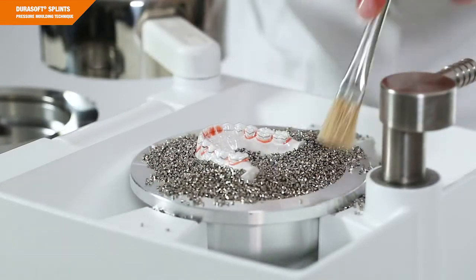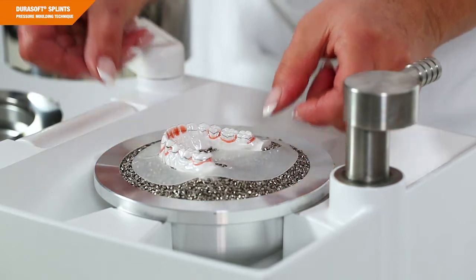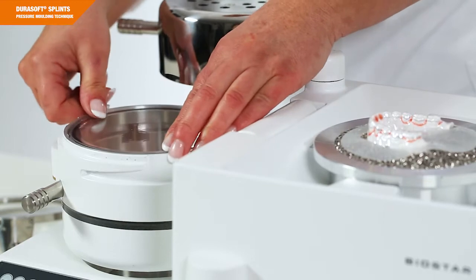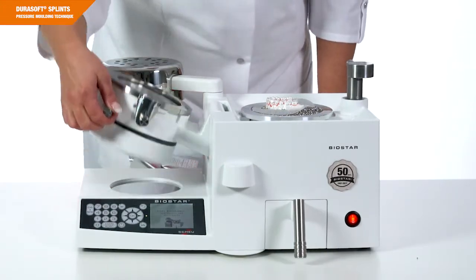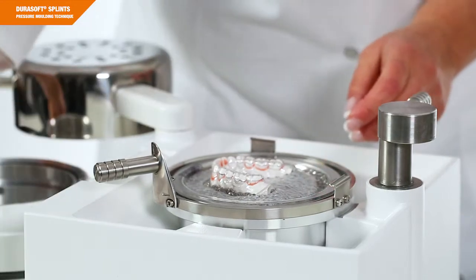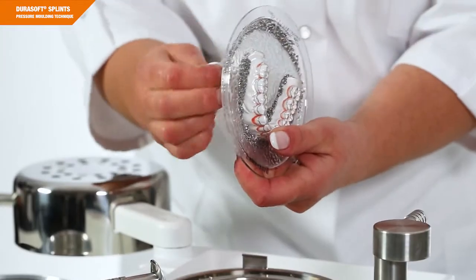We recommend using the pellet cover to minimize the loss of pellets. In the next step, the DuraSoft PD material is heated and then thermoformed over the DuraSoft seal foil. Thanks to pressure and heat, a non-detachable connection between these two materials is achieved during this process.